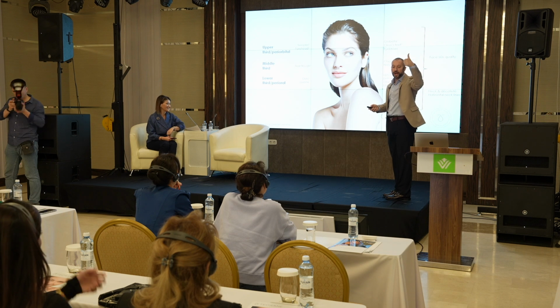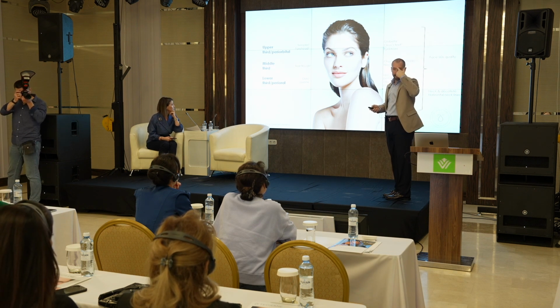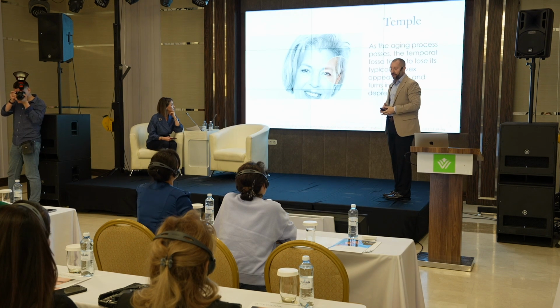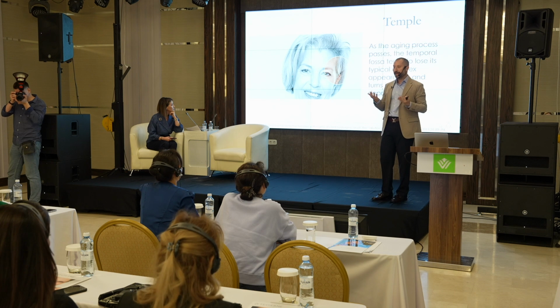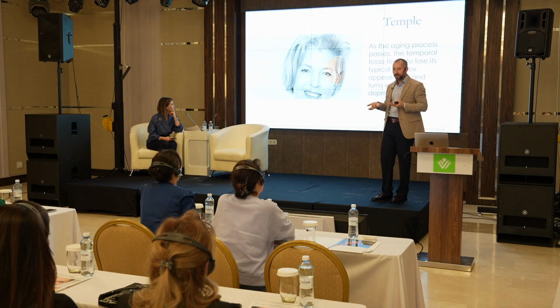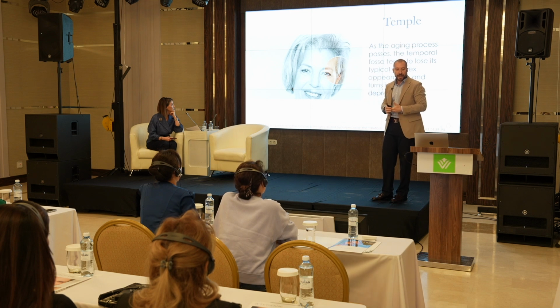I told you I will start with the temple, forehead, eyebrow, and glabella injections. So let's start with the temple. Why do we inject the temple? Usually it's not easy to catch the patient. In Asian race, the temple is not so hollow, I think. I can see in the Caucasian patients it's more hollow or more deep.